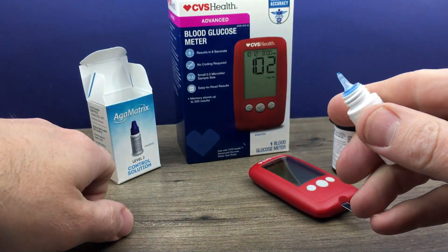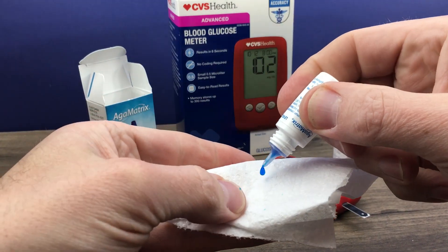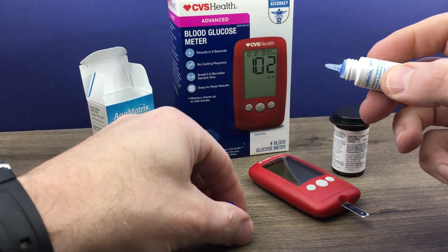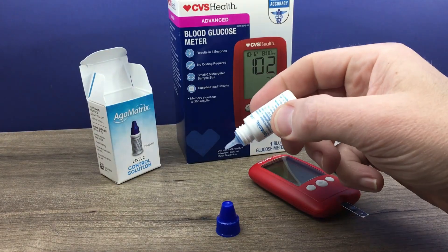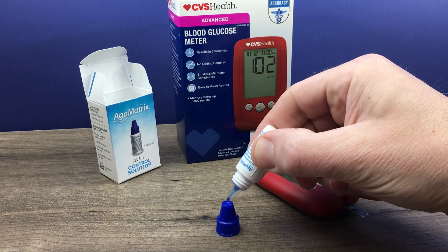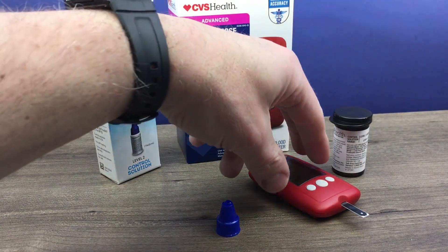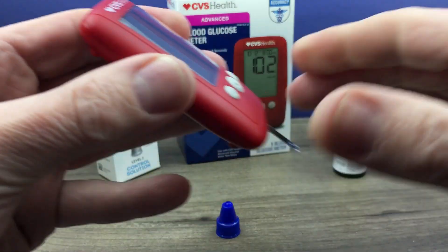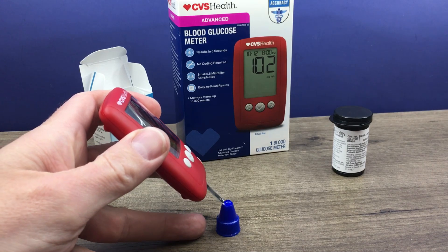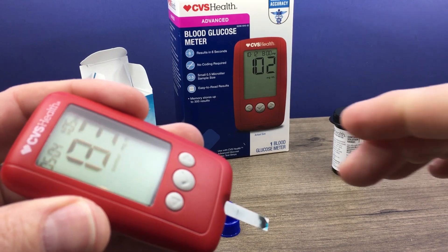They do recommend that you discard the first drop of control solution. Wipe the tip clean. And then the drop you're going to use, they recommend putting it on a piece of clean plastic. The lid looks like it'll work for us, so we'll put a drop on that. Then we take our test strip and just touch that to the control solution. When it beeps, we remove it and we wait for the reading.